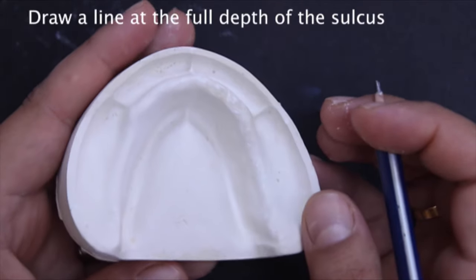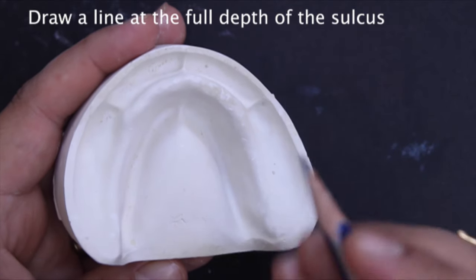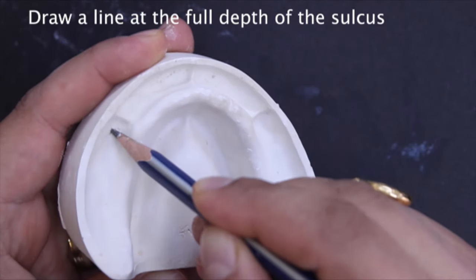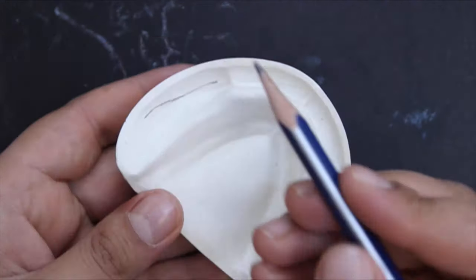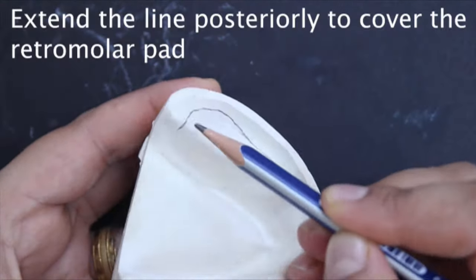Mark the outline of the mandibular denture bearing area. Draw a line that extends to the full depth of the buccal and the lingual sulcus, extending posteriorly to cover the retromolar pad.